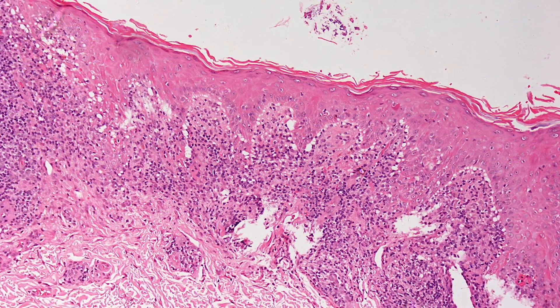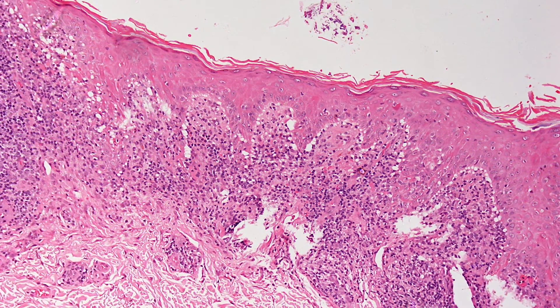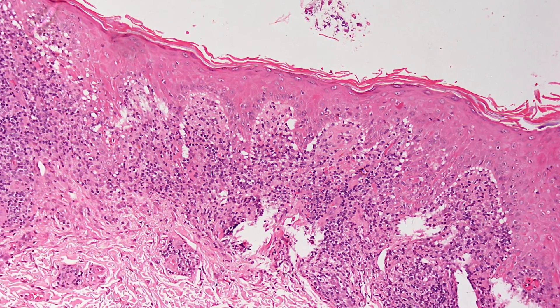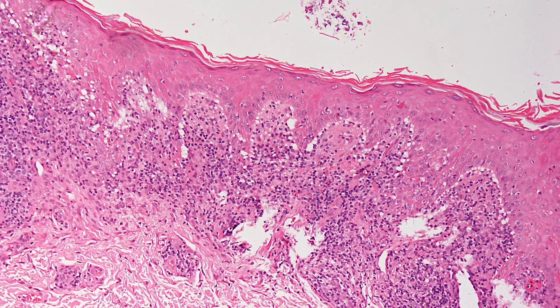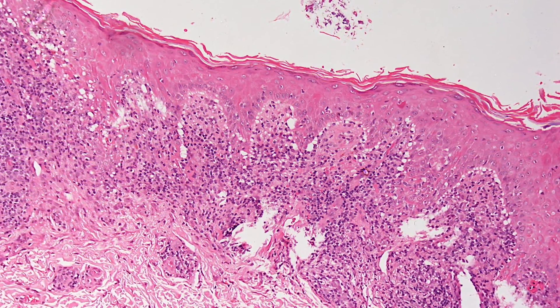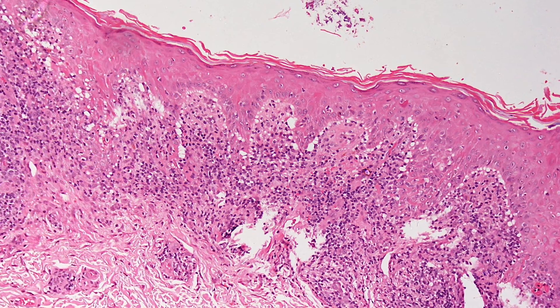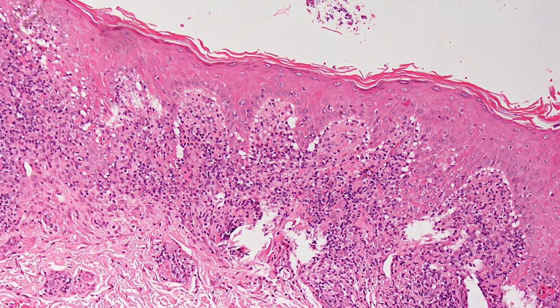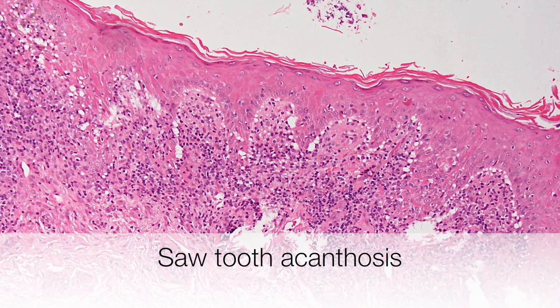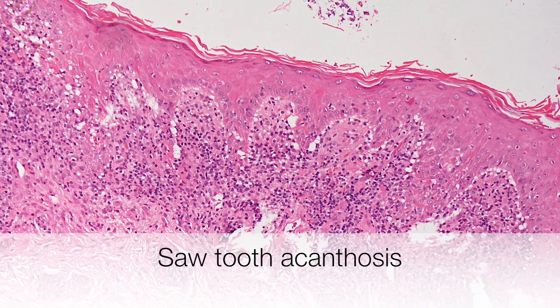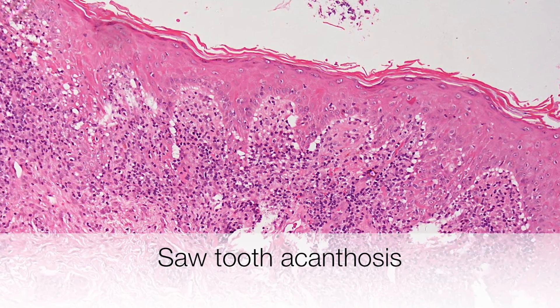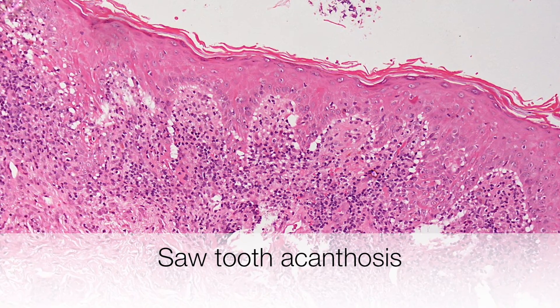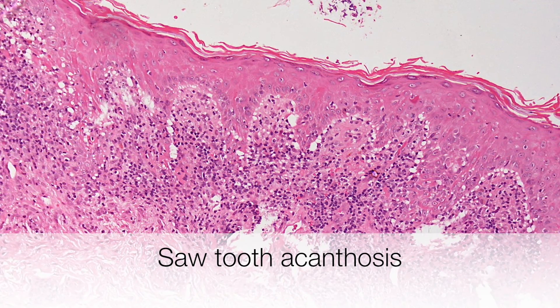The low power view of the skin biopsy shows the characteristic band-like chronic inflammatory infiltrate and irregular acanthosis with sharp pointed rete ridges. This is a nice example of the sawtooth acanthosis in lichen planus.